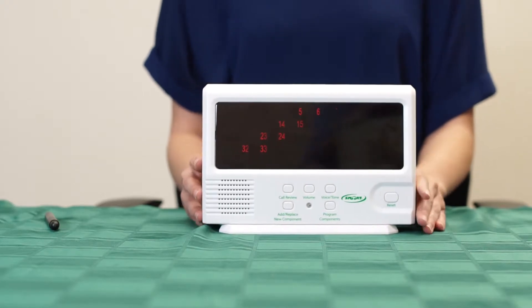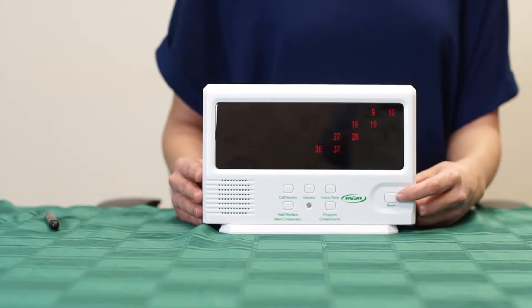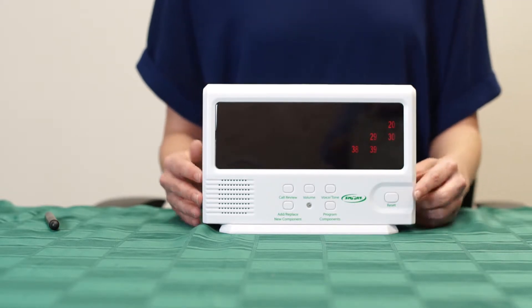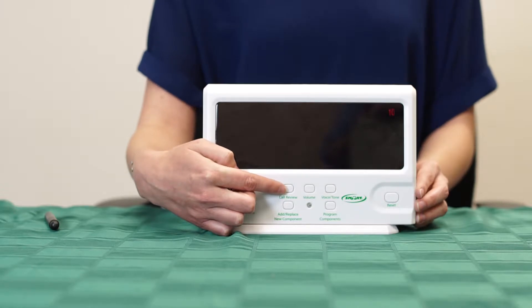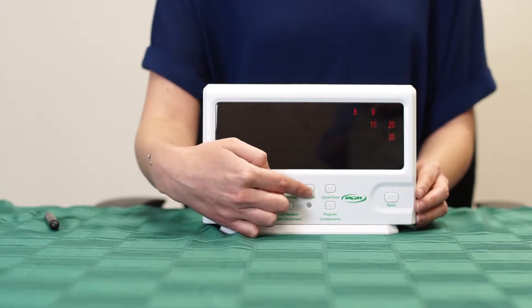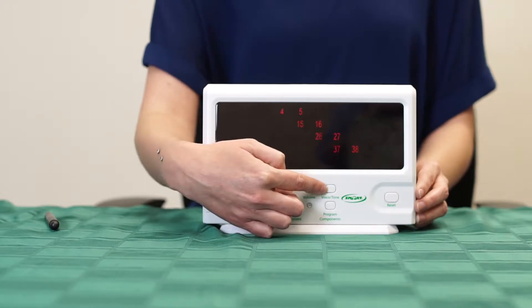Here is a quick overview of the buttons on the central monitor. The reset button will reset the alarm and silence the monitor. The call review button can be pressed to review the previous components that have set off the central monitor. The volume button will change the volume of the central monitor. The voice/tone button will change the tone to various options and languages.